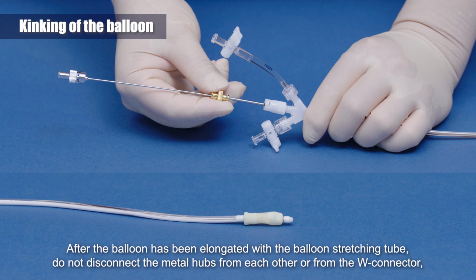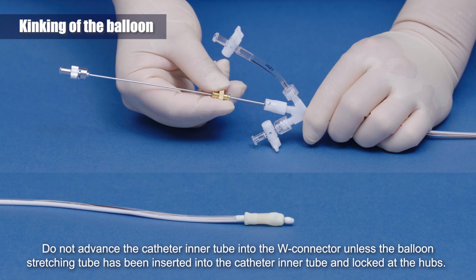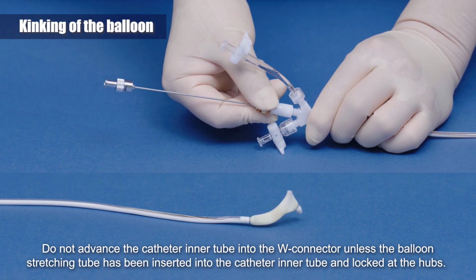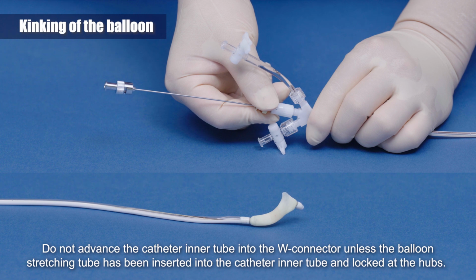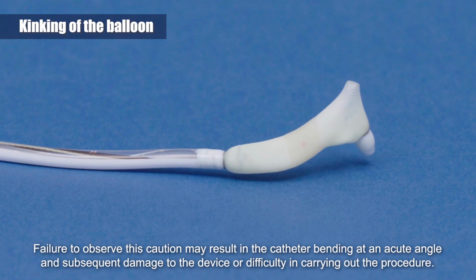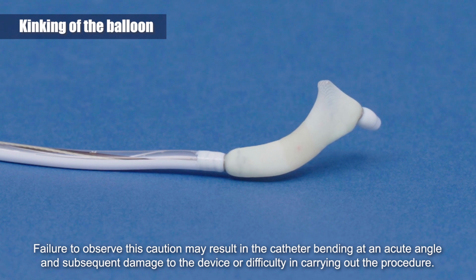Do not disconnect the metal hubs from each other or from the W connector, unless the guidewire is in place and the coiled portion fully protrudes from the catheter tip. Do not advance the catheter inner tube into the W connector unless the balloon stretching tube has been inserted into the catheter inner tube and locked at the hubs. Failure to observe this caution may result in the catheter bending at an acute angle and subsequent damage to the device or difficulty in carrying out the procedure.